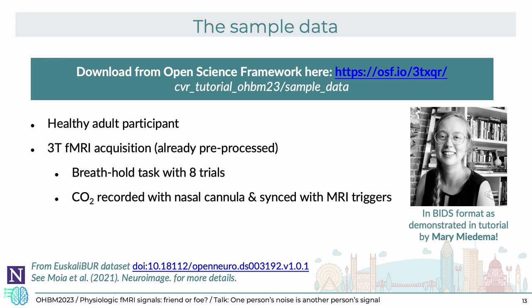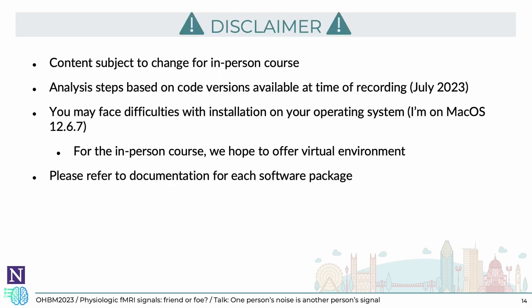Before we start the tutorial, I want to give a disclaimer that the content shown here may be different on the day of the educational course. The analysis steps are dependent on the code versions that are available at the time of this recording in July 2023. I understand you may face difficulties with installation on your operating system, and I would recommend referring to the documentation for each software package, but I'm also happy to try to answer your questions as I can. And for the in-person educational course, we hope to offer a virtual environment that will allow everyone to participate.